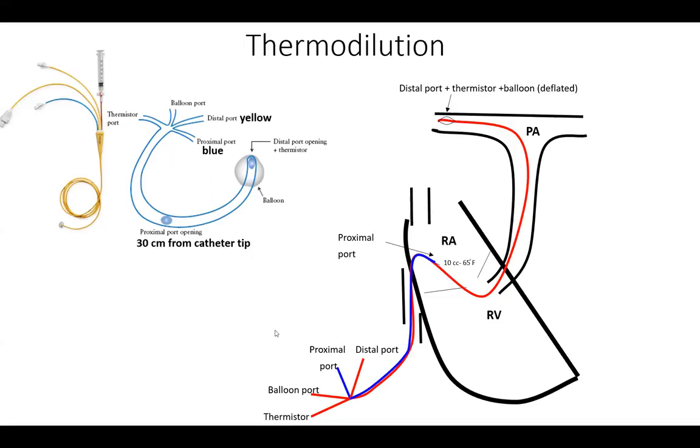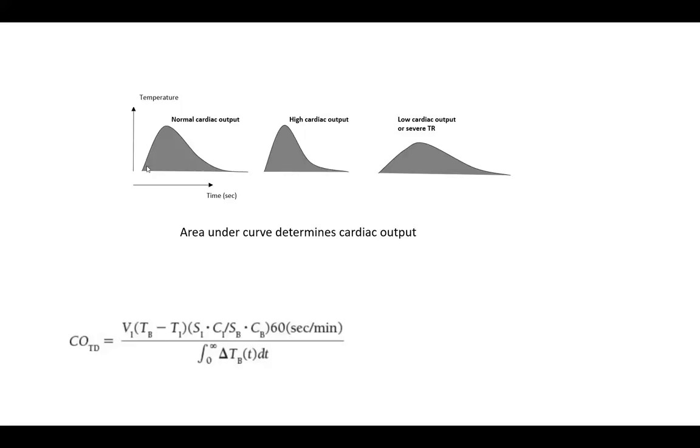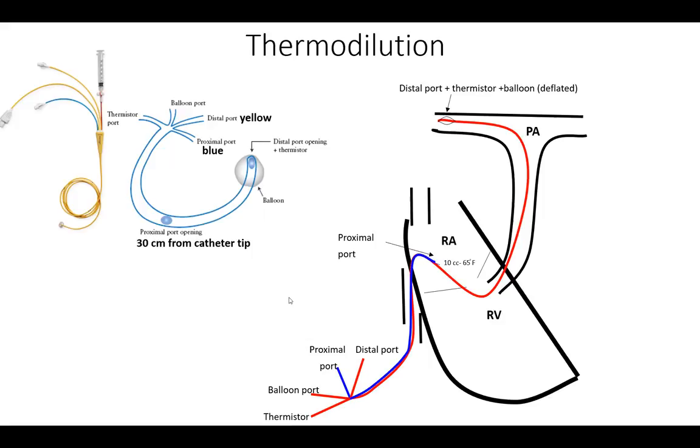So I will go back to this and mention some other caveats. Now, even assuming you're injecting, let's say the example where you inject slowly, rather than instantaneously, you inject 2-3 cc's per second. Well, you will spread out this curve by the fact that you're injecting it slowly. Again, the equation assumes everything is coming immediately, instantaneously. So you inject it slowly, you'll spread out that curve and you'll create a falsely low cardiac output. You can try it, by the way, on the next case. Try a couple where you do it differently. Try also injecting 5 cc and see what happens.